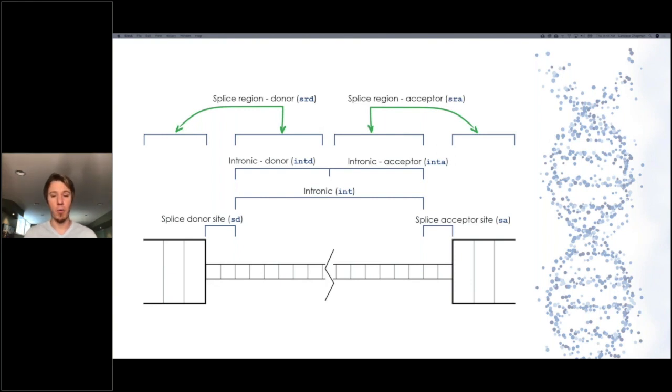One area where this is especially prominent is in the intronic regions of a gene. Before, if you searched for a variant in an intronic region, we would categorize all intronic variants together, so that if there was no specific reference to your cDNA level change, we would at least show you other variants that matched whatever filters you queried on: disease, therapy, phenotype, or ACMG or AMP criteria or other categorical keywords.